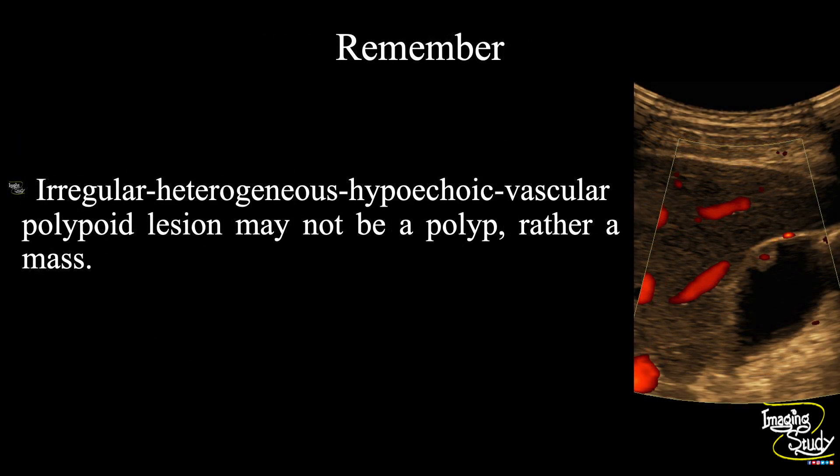Now the take-home message: an irregular, heterogeneous, hypoechoic, and vascular polypoid lesion may not be a polyp — rather, it is a mass.